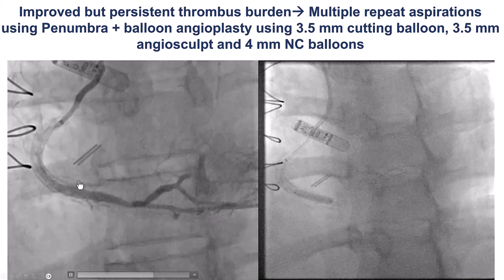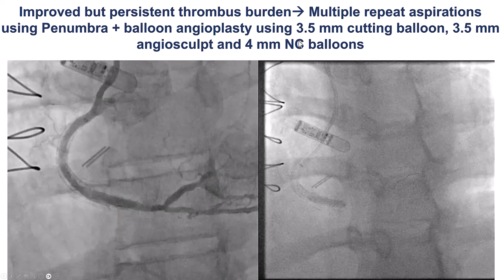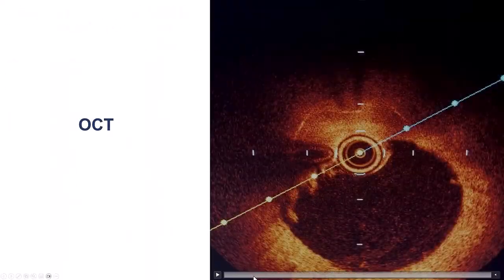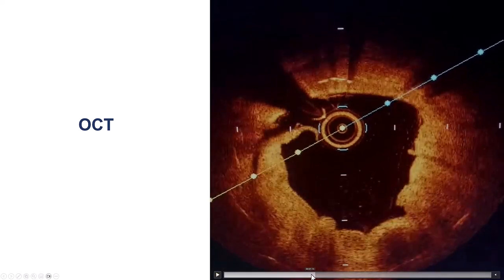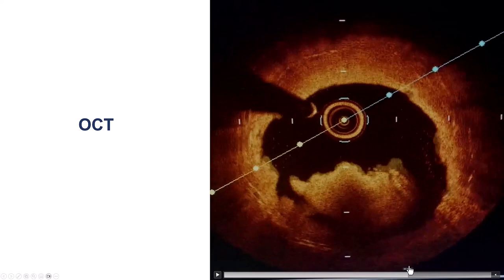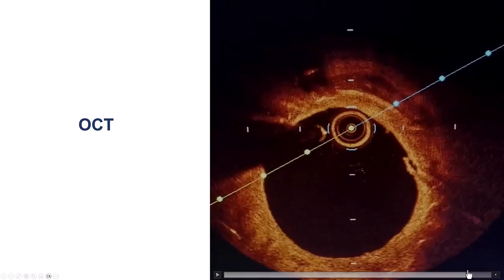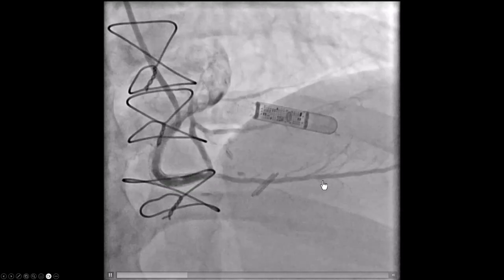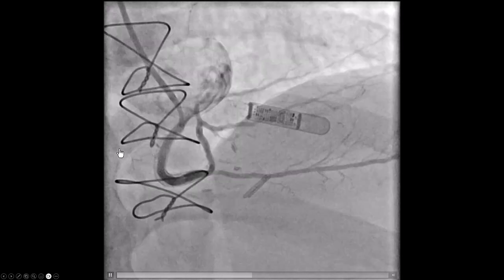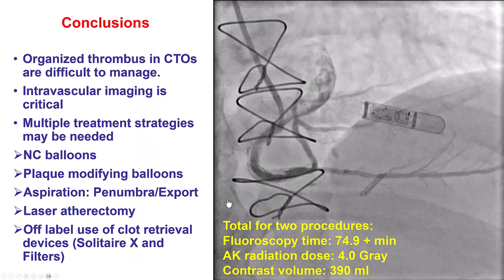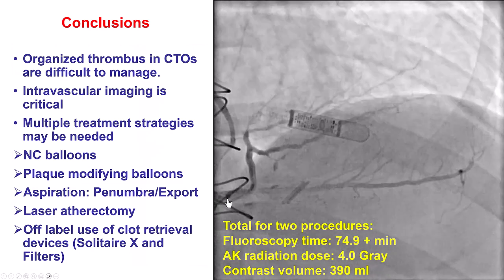The result was better though not perfect, so we did more balloon angioplasty with a cutting balloon AngioSculpt 4 millimeter balloon. OCT still showed thrombus burden, less than before but still present in the RCA within the previous stent, as well as in the more proximal part. The final angiogram showed TIMI flow into the PDA and posterolateral, but still filling defects in the RCA. We decided this was enough — we had done essentially everything possible to treat the thrombus.